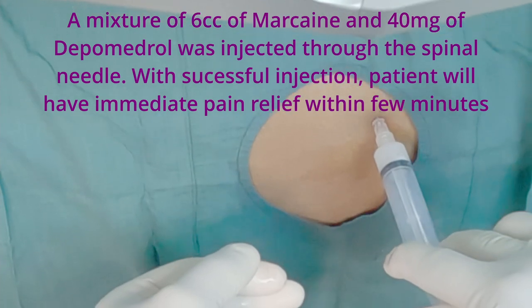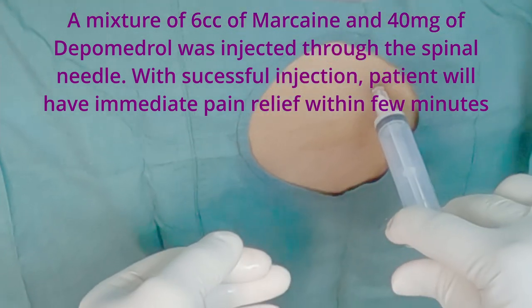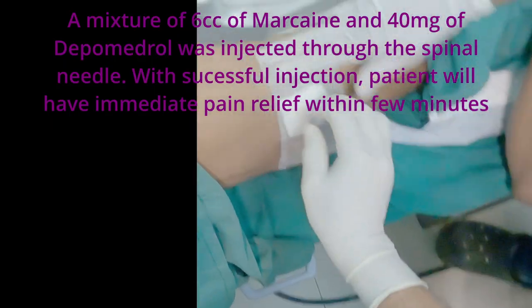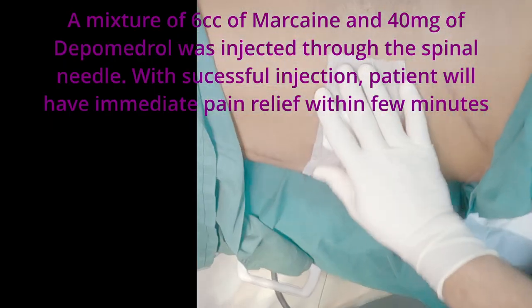A mixture of six cc of marcaine and 40 milligrams of depo-medrol was injected through the spinal needle. With a successful injection, the patient will have immediate pain relief within a few minutes.